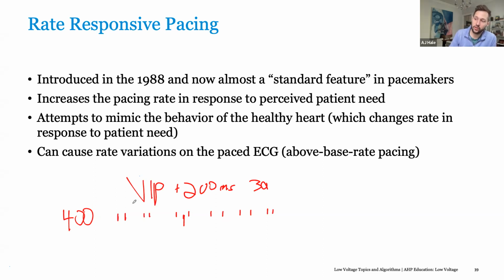We're still following the atrium, and we're shortening AV delays the rest of the time when they aren't conducting. So you're getting the best of both worlds. We're reducing RV pacing percentage, but we're also increasing the amount of atrial kick by allowing intrinsic conduction and not waiting too long. Does that make sense?